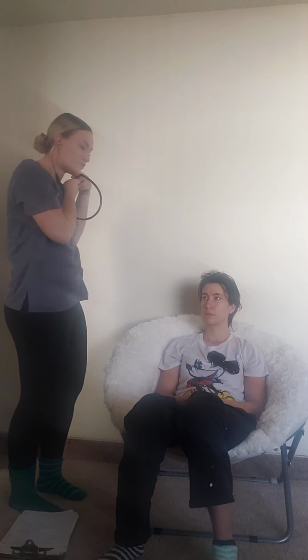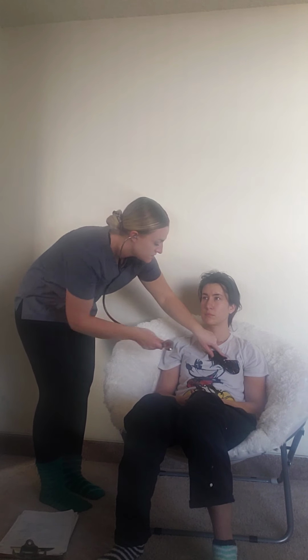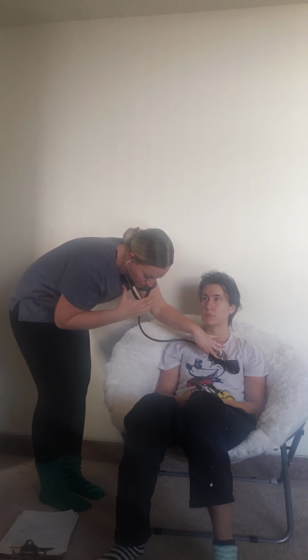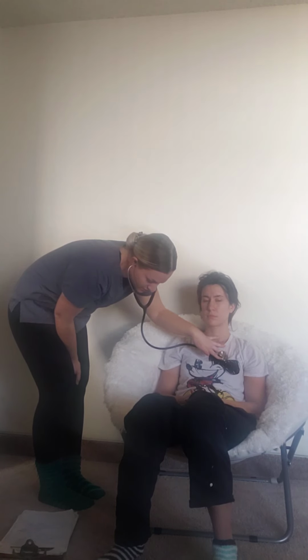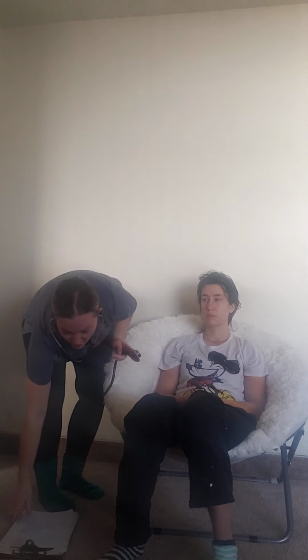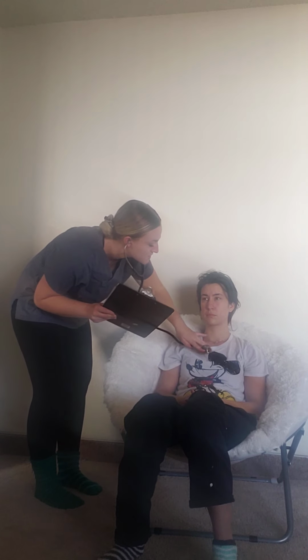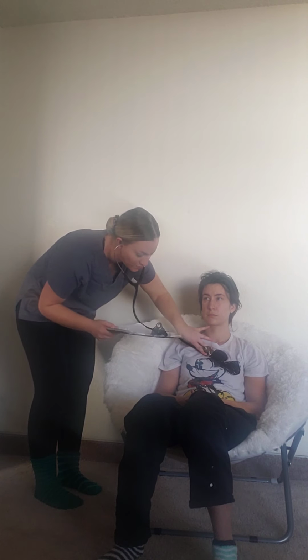I'm just listening for abnormal heart sounds. We're hearing a 1, 2, and it's right on the border, so I'm gonna do here. You just breathe normally. Alright, sounds good. The next one is going to be the pulmonic, which is at the left sternal border, at the second intercostal space. I'm going to find 1, 2, and put it here. Listen for any more.